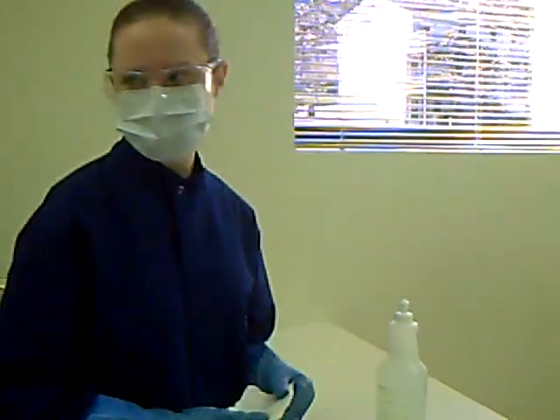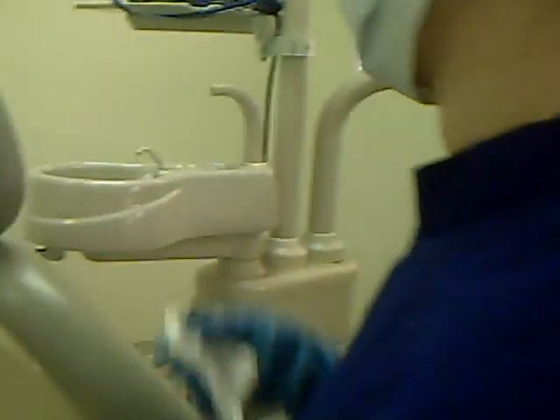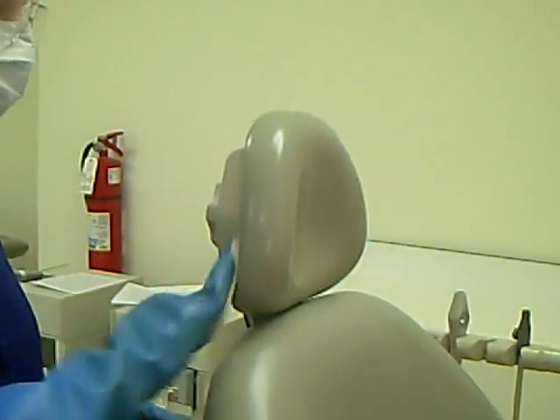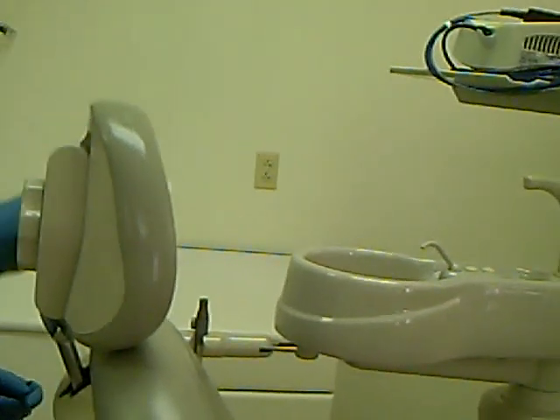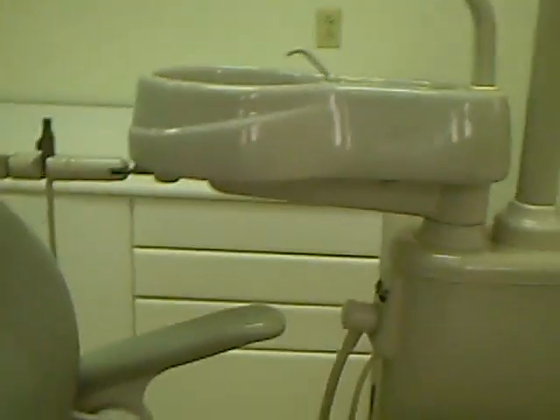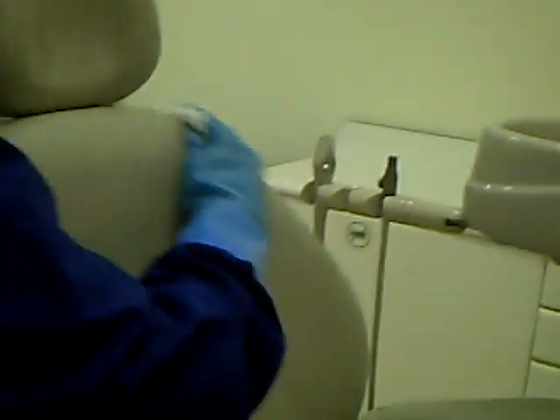Next, move on to wipe the patient chair. Start with the headrest, wiping from top to bottom and from front to back. Then move on to the rest of the chair. Don't forget the armrests and the bars connecting the arms to the base of the chair.